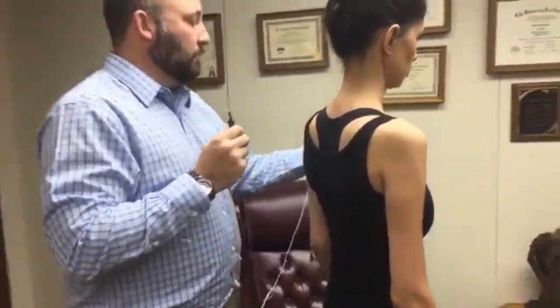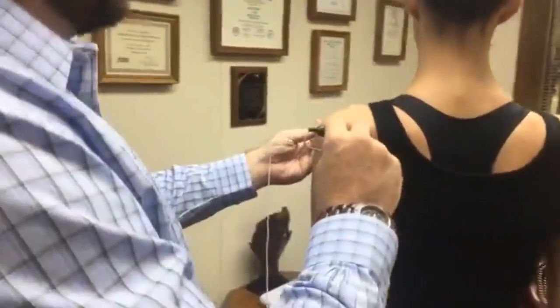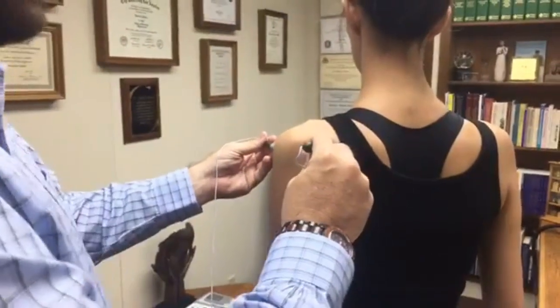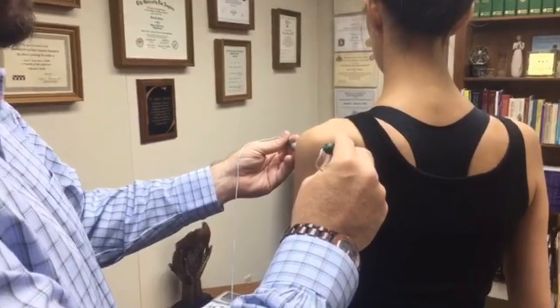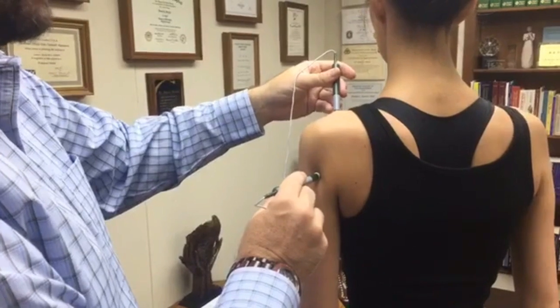Step three is an X on the opposite side. We're going to do a quick 20 seconds on her left shoulder also. The current does relax muscles, and you want to relax muscles on both sides symmetrically. So if you're treating an ankle or a knee, you want to make sure you relax those accessory muscles on the opposite side. We just do a quick 20 seconds.